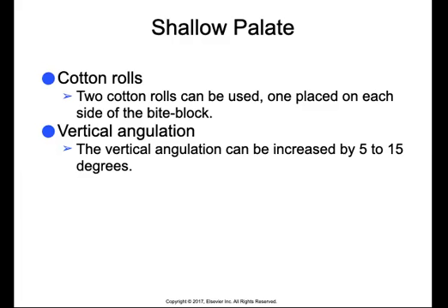So in some sense, it's good that we're getting that type of practice because you'll be able to get over or find ways around how to take images with somebody with a shallow palate.